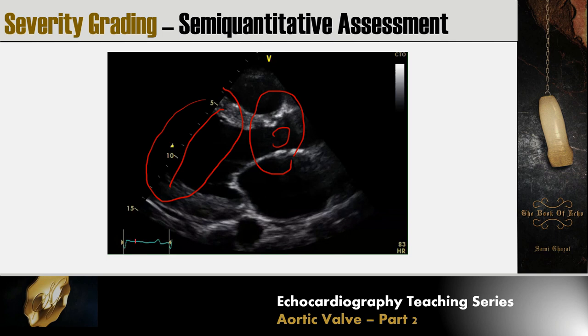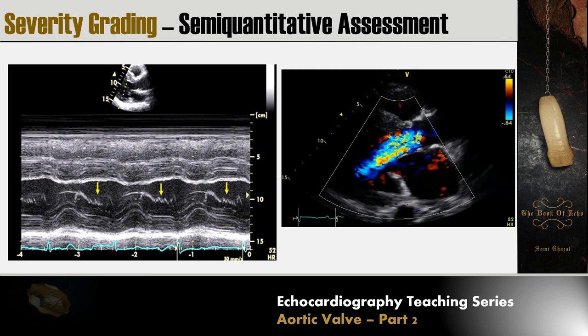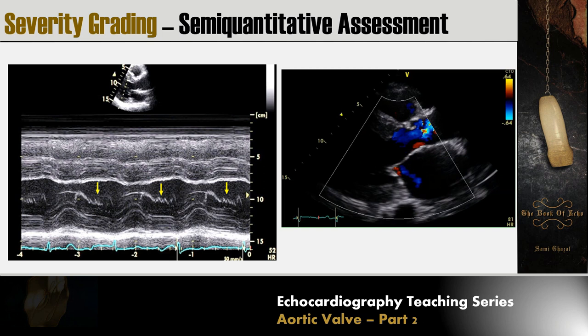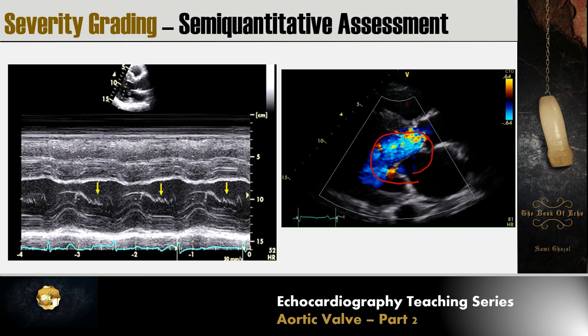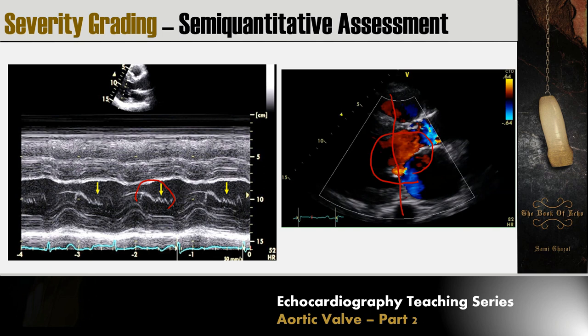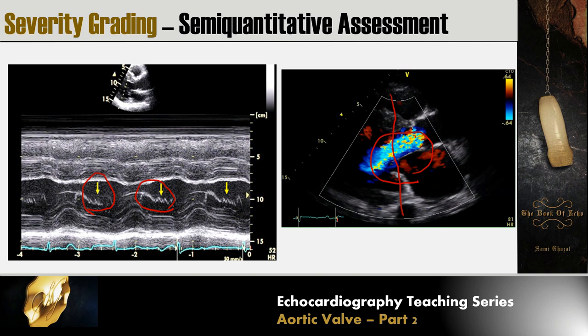LV function is also important; after a period of severe aortic regurgitation, LV systolic function will become impaired. Moving from 2D to M-mode, if significant aortic regurgitation is hitting the anterior mitral leaflet, placing an M-mode there will show fluttering waves at the anterior mitral leaflet, indicating significant aortic regurgitation.